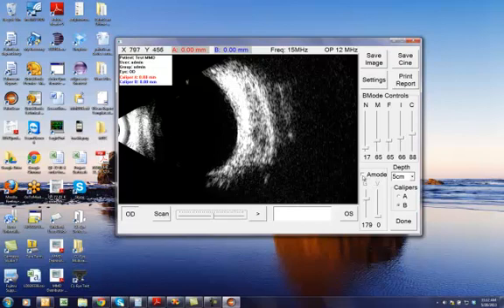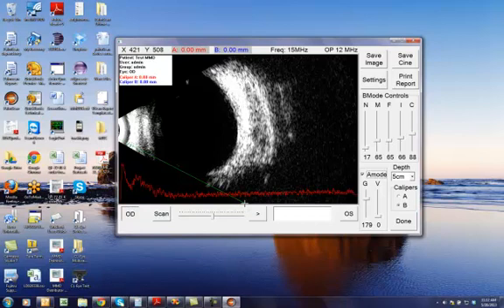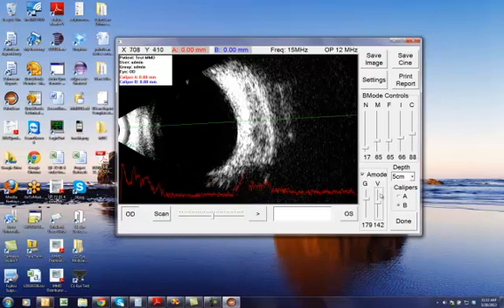If you wanted to see the A mode vector, you click on the A mode checkbox here. You will see a green vector selection tool that matches with the slider that's under the V slider, so that tells you which vector you're actually looking at.